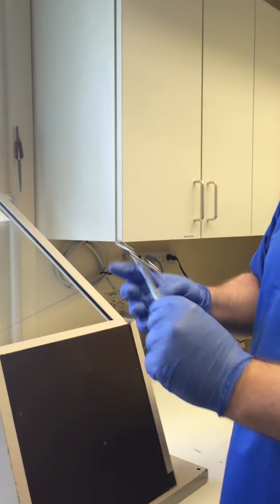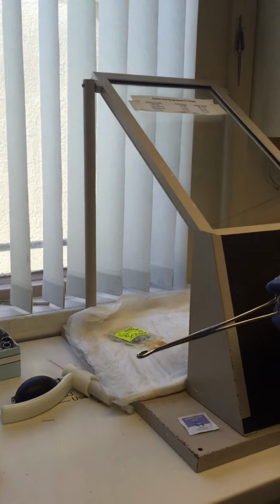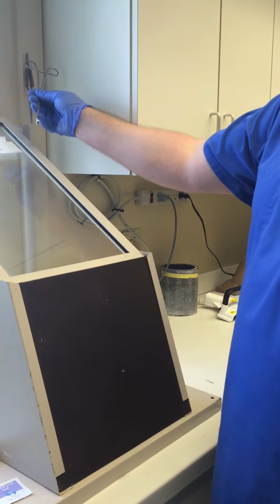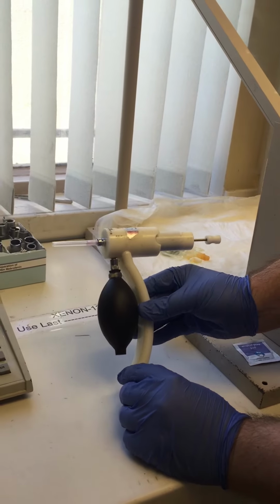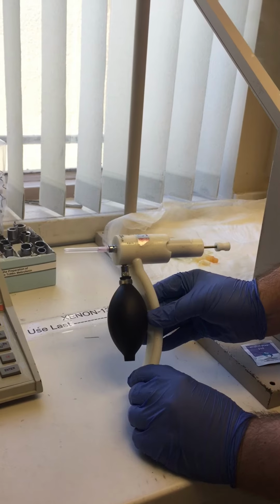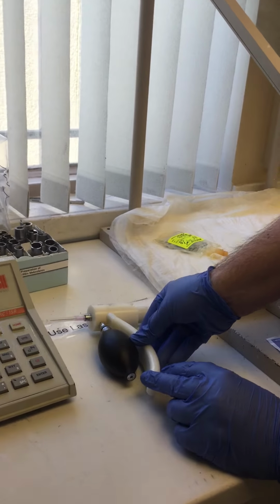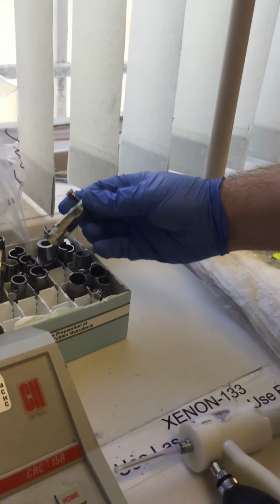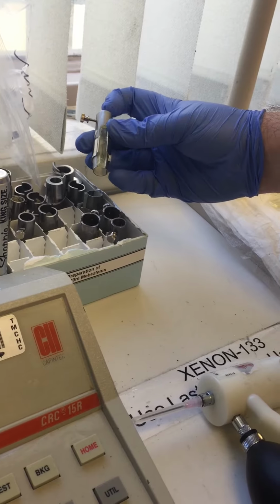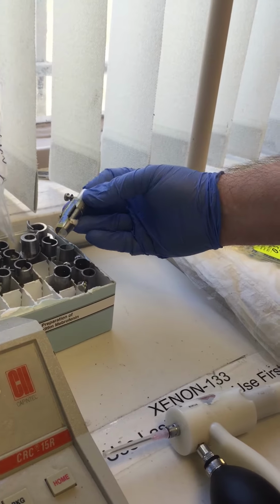Here's tongs, so that when we're handling radioactive materials, we can use a safer distance, which will also help with exposure. And right here, this is actually called a xenon gun, and it's an instrument we use to administer radioactive xenon gas for when we're doing lung imaging. And then right here are syringe shields, so they're the lead shields that we put the dose in to also protect us and our patients while we're administering the doses.